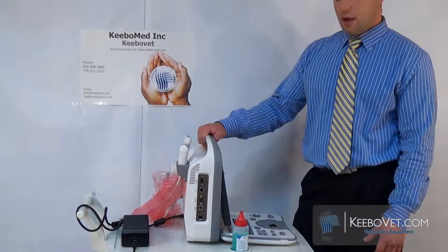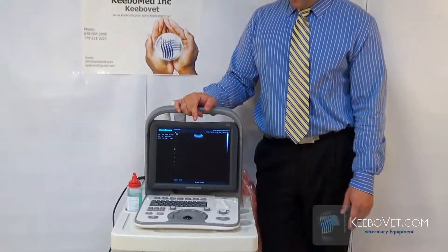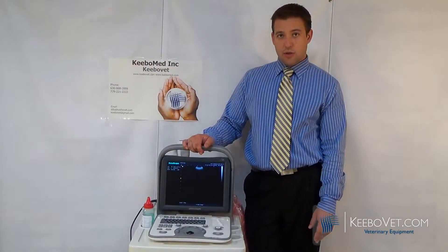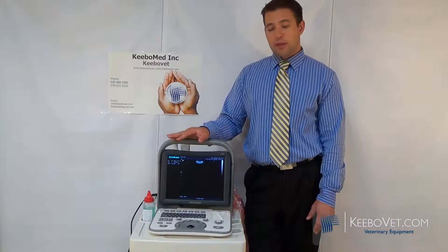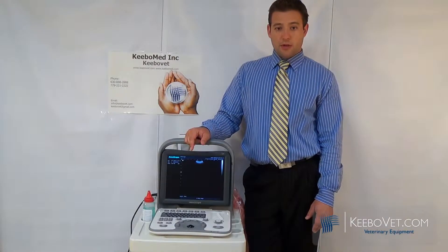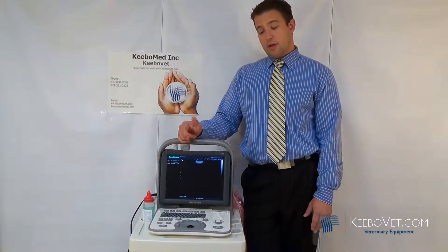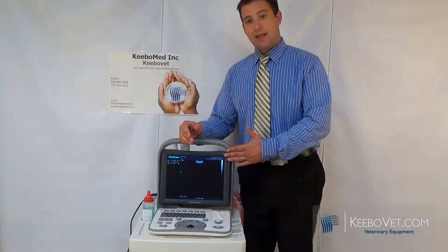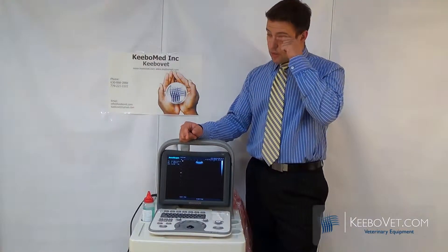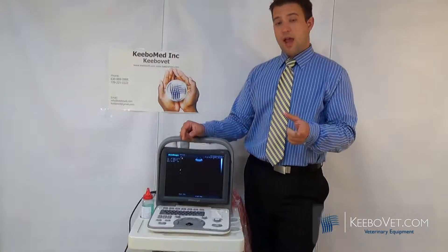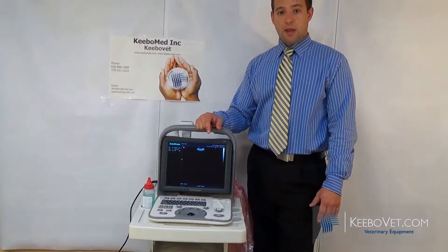Continuing on functions, this machine supports up to eight different transducers — everything from curved, cardiac, to linear. The frequency range goes from 2 MHz to 12 MHz, which governs image resolution and depth. The lower the frequency, the deeper you can go; the higher the frequency, the shallower but with higher resolution. Many competitors only offer 4 to 10 or 2 to 10 MHz. We go from 2 to 12, giving you the full broad range to find the right transducer for your application.